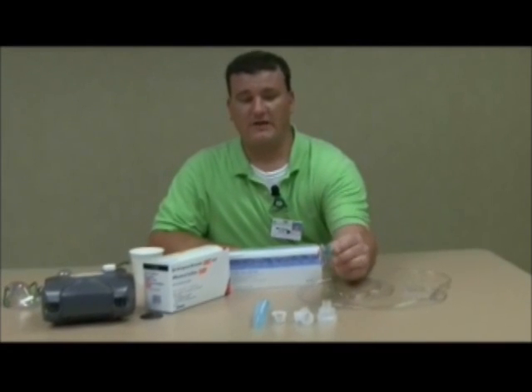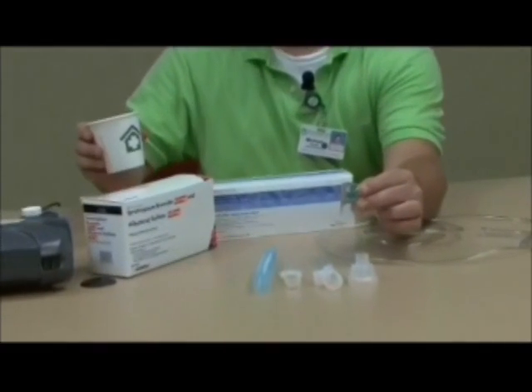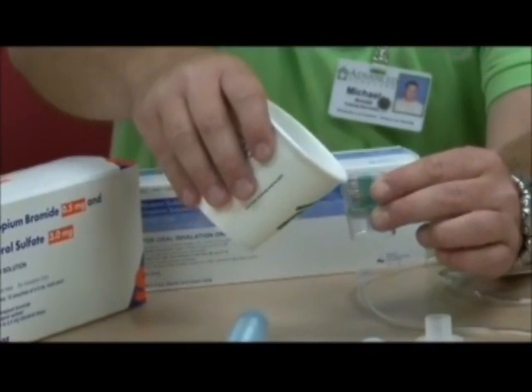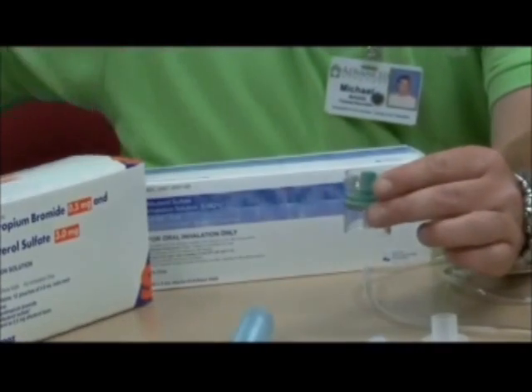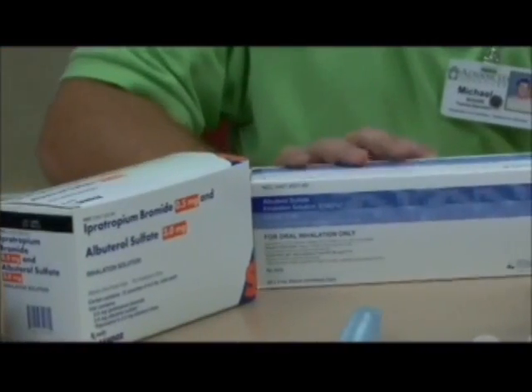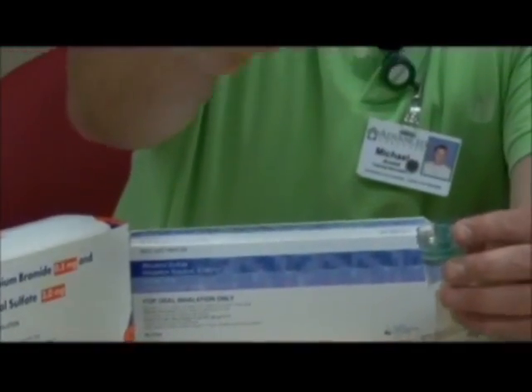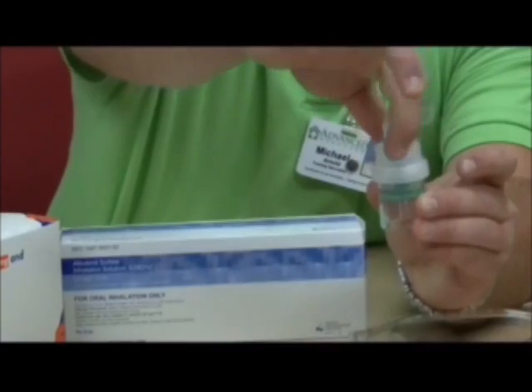Step two, inserting your medication into the nebulizer kit. First, you will need to grab your medication cup. I'm going to use water for demonstration purposes. You would insert your medication in through here. Your medication will come in boxes such as the ones on the table. Next, I'm going to take the nebulizer medication cup lid and screw this on. Make sure you evenly thread it on.